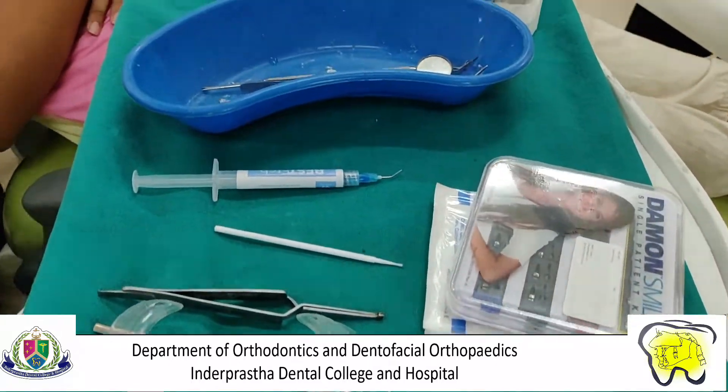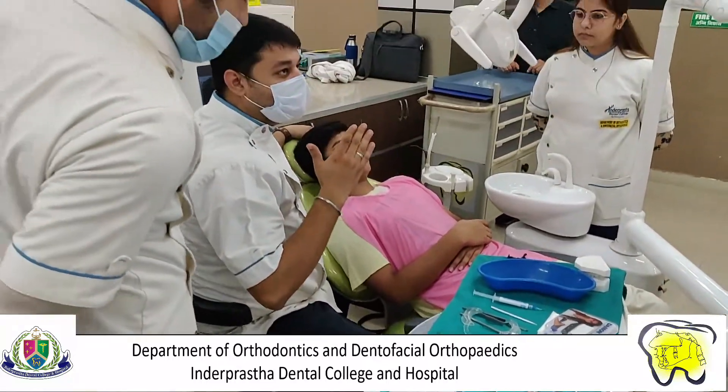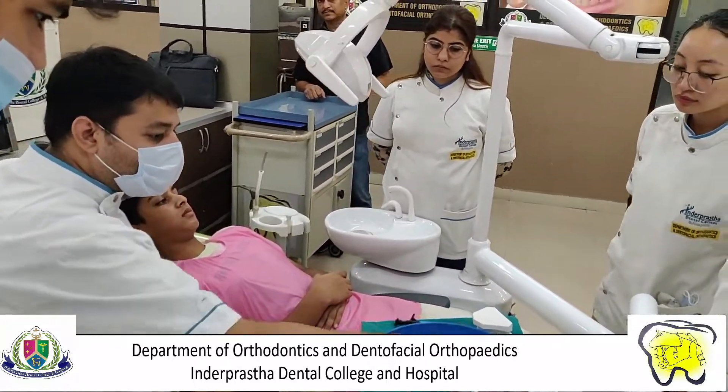Damon braces are a self-ligating bracket system that uses unique high-tech wires to straighten teeth faster with lesser pressure, lesser friction, fewer appointments, and fewer adjustments.